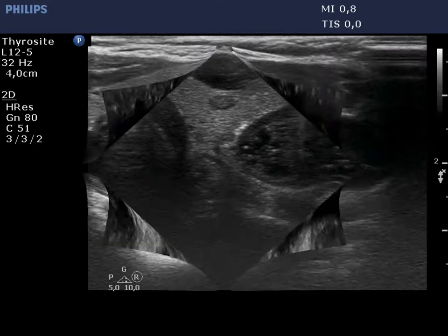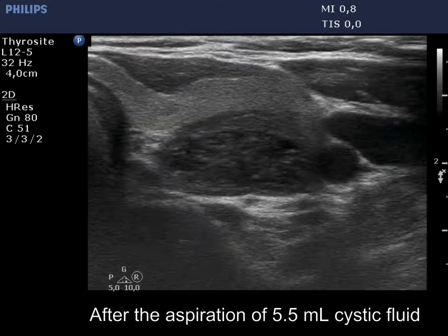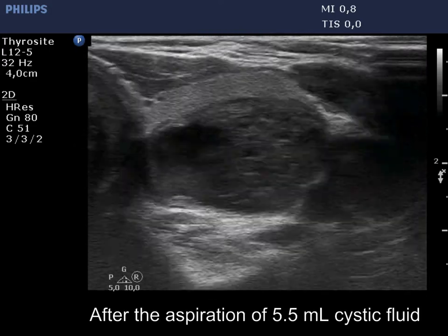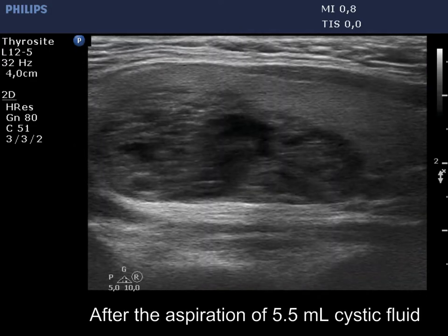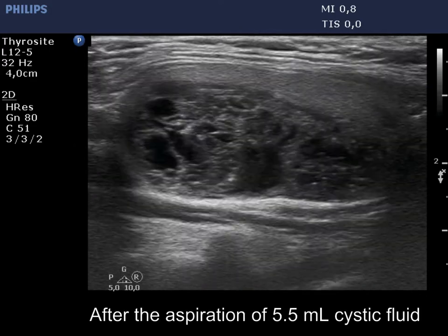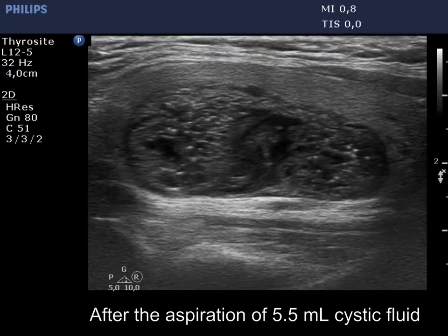Due to the presence of solid areas, the nodule does not entirely fulfill the criteria of a spongiform nodule. Let's take a look.